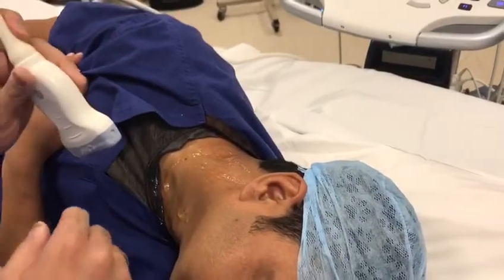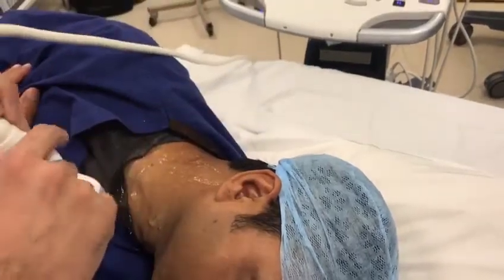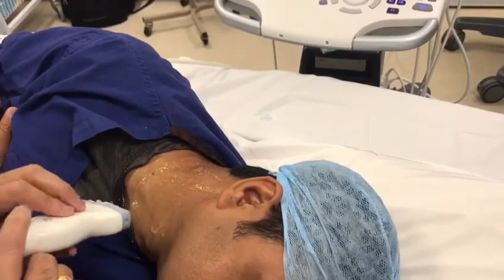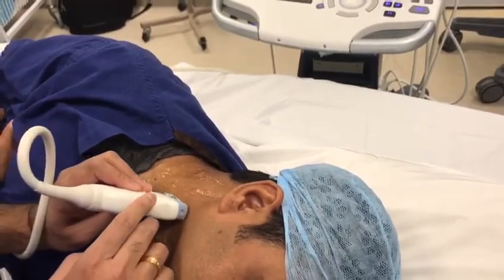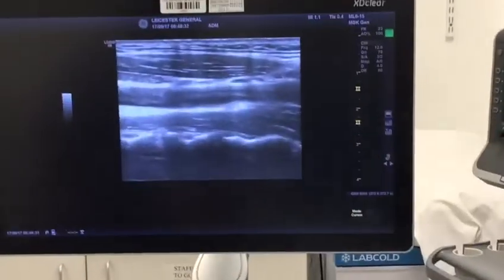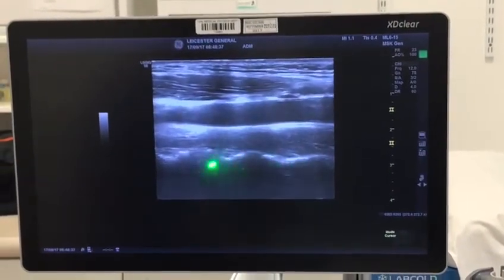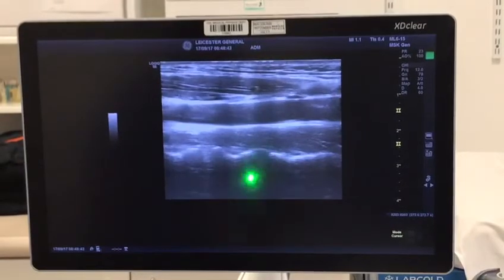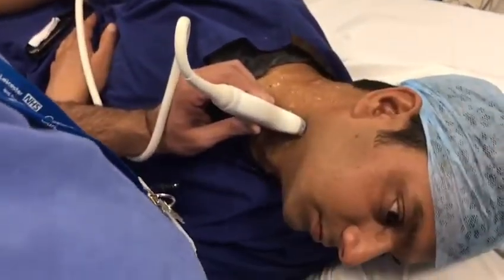In order to scan the cervical medial branches, you need to look at the bony silhouette, which gives a wavy pattern on the ultrasound. I'm going to show you two wavy patterns, and it's very important to appreciate these two wavy patterns. We start medial to the sternocleidomastoid muscle, and you can see this wavy pattern, but basically this is not the cervical facet joint line or the articular pillar. It's the cervical vertebrae, and as you could see, that's a disc. So please do not perform the injection at this level because you're way anterior, and you can see the vessel. That's your internal carotid artery.